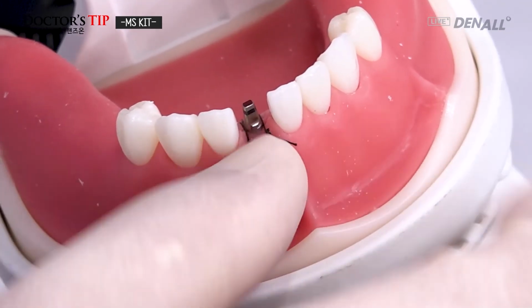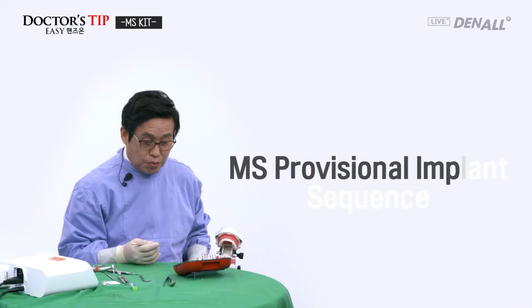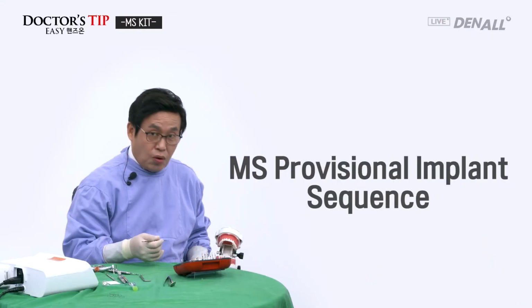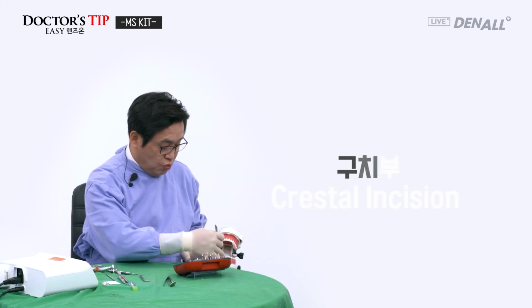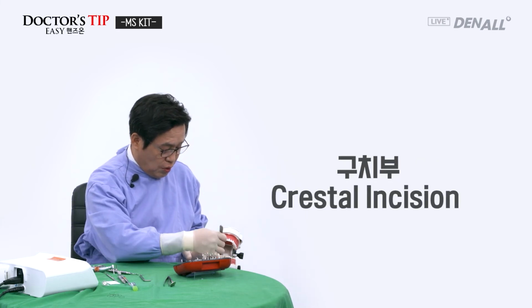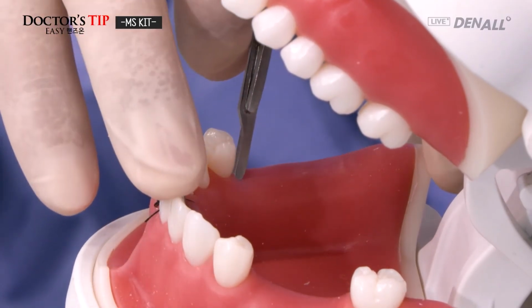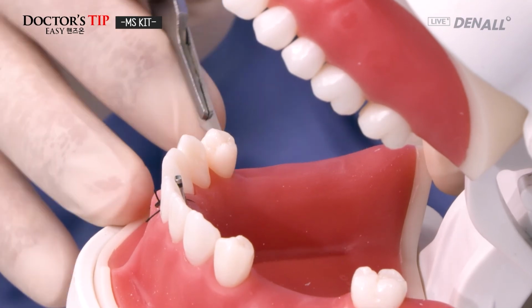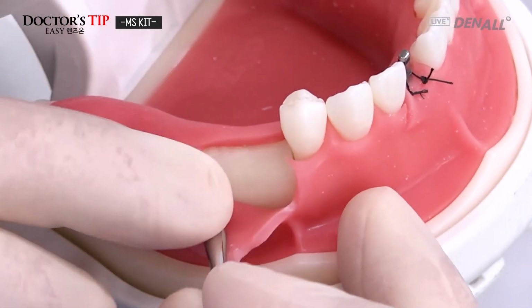Like this. An MS implant is placed, and now you can create provisional restoration. Next, let's see the provisional implant sequence, and I'll show you how it can be bent. So I'll put one on the molar area, crestal incision, and then flap is elevated.